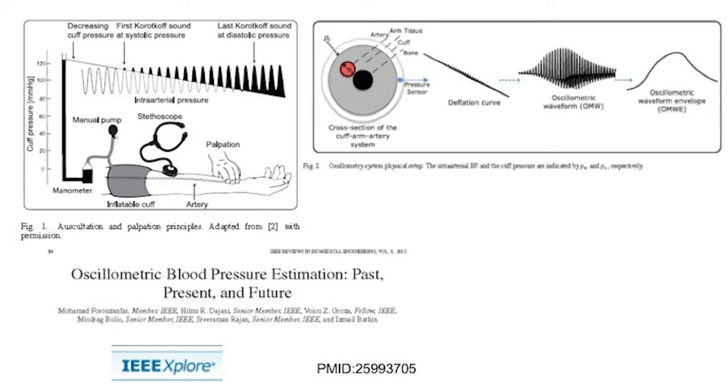And if you look at it as though you're taking a mercury, all the things that have to do with mercury-based blood pressure measurement are also true in aneroid and oscillometric as well. Miscuffing and malposition of the arm are amongst the mortal sins here as opposed to the venial sins when it comes to the technique. And the issue with calibration can give you a false sense of security.